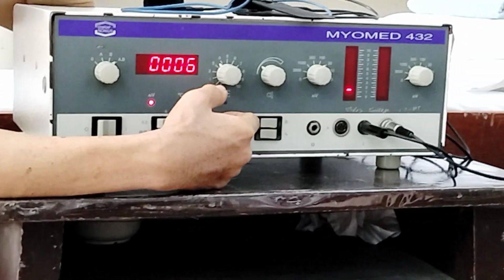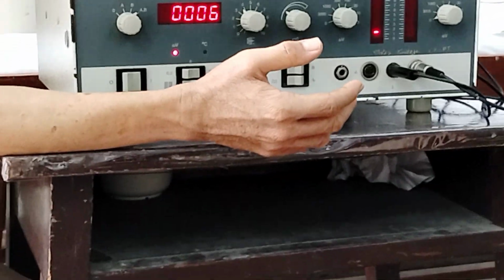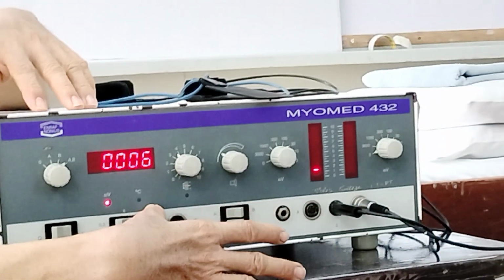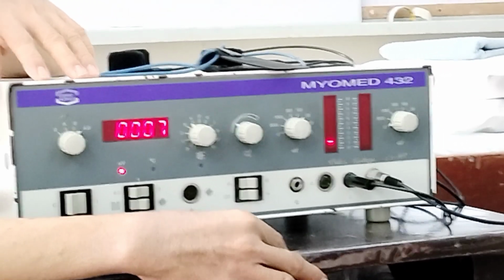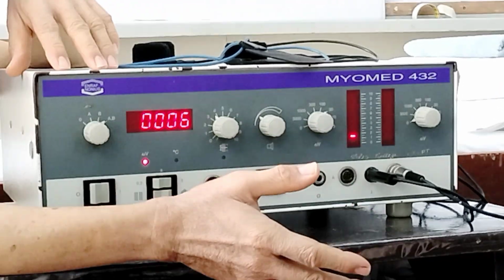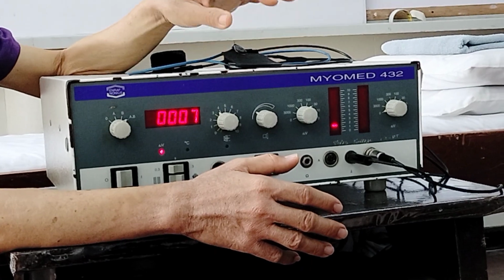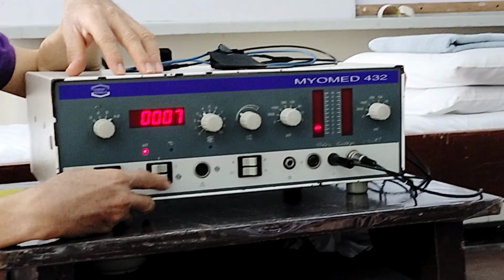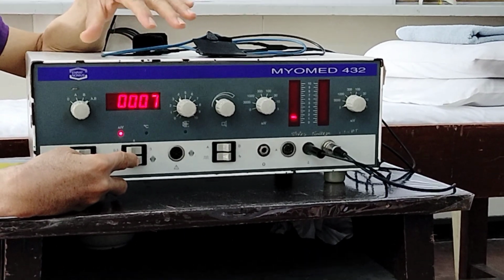So we use this for muscle relaxation. Usually in relaxing the muscle, the changes happen slowly, so 3 seconds is okay. But if you're asked whether we can use 0.3 seconds for muscle relaxation, that would not be appropriate. Okay?